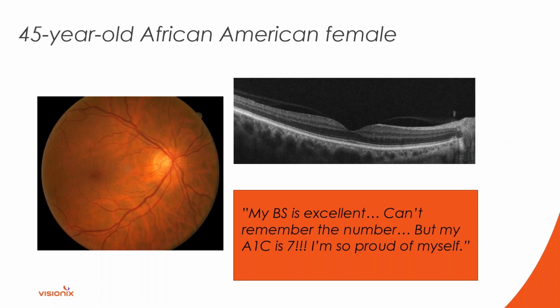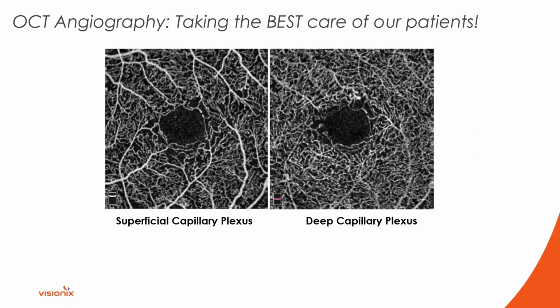So at this point, before the advent of OCTA, I would have told my patient that you're right, you are doing amazingly well. I'm going to send a note to your primary care physician, letting them know how well you're doing. But you know what's coming, because this lecture is on OCT angiography and taking the best care of your patient. So we do OCT angiography on our patient, and this is what we see.